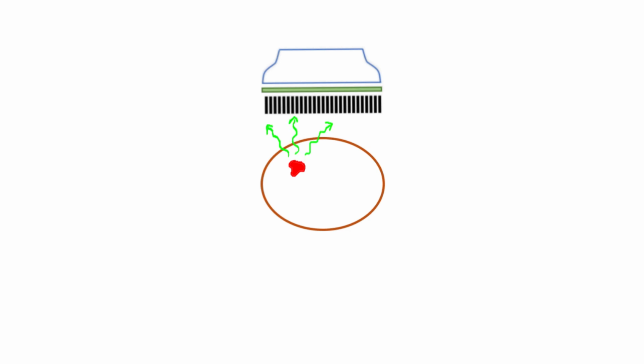So what you have here is a scintillator, okay, that turns particles into optical photons. And then behind that, a position sensing photomultiplier array, so it can tell where the particle landed on the face of this detector. This is a two-dimensional planar detector. And then in front of that, you have a collimator. Okay, and that means that particles coming in this way, for example, can get through, but coming in sideways, they can't. And so that gives you kind of a low-resolution imaging capability.